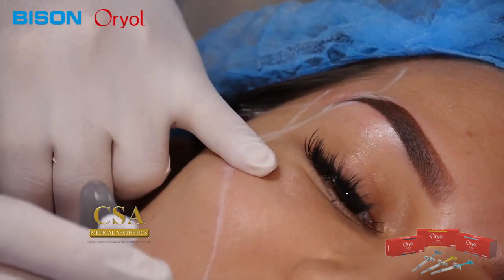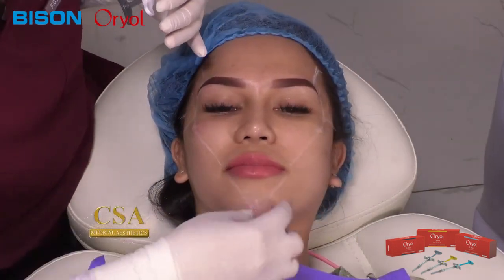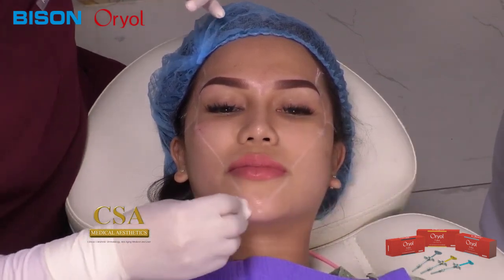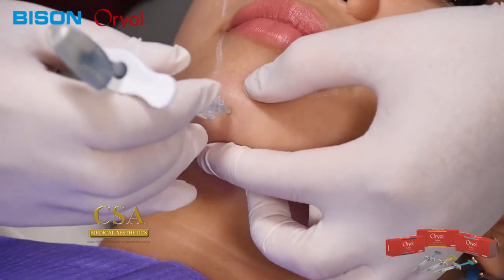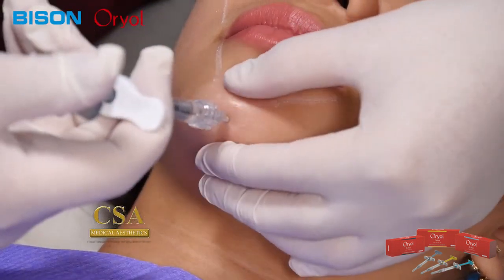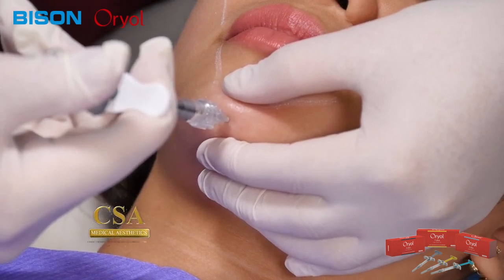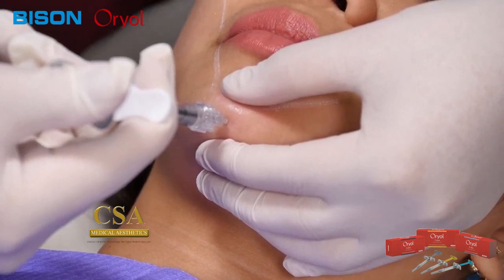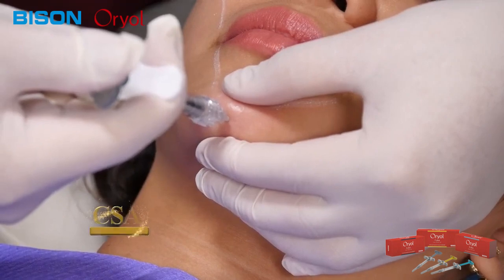And finally, on this side, I'll also be injecting the apex of the chin. We just want to improve the so-called anterior projection. So we'll target the chin apex here, the symphysis menti, onto the bone, and then aspirate a bit. I still have 0.2 on my syringe here, and just a bolus injection. You're perpendicular onto the symphysis menti. We're improving the projection of your chin, and almost done there. 0.2 ml, and there you go.